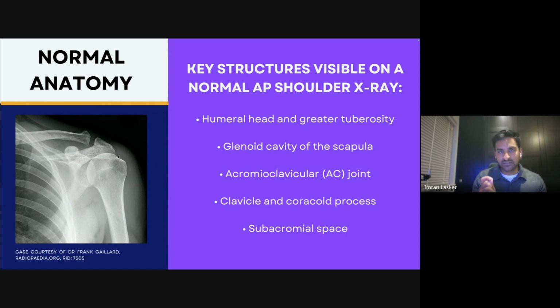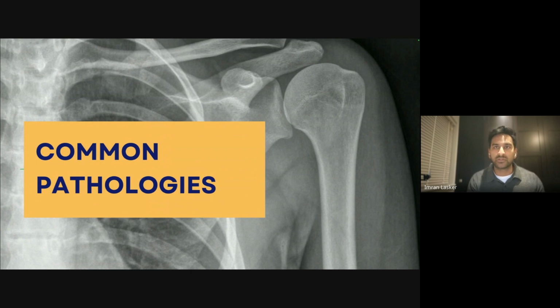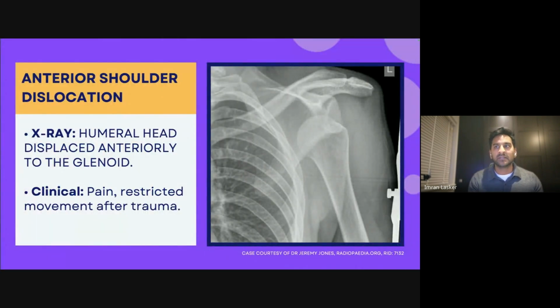But when you look at that space under ultrasound, it is literally the thinnest space. I don't know how they do it. I don't know how to do it, but without ultrasound, I don't see how you can do that accurately. Right. So let's have a look at a few pathologies that exist when you are looking at the shoulder.